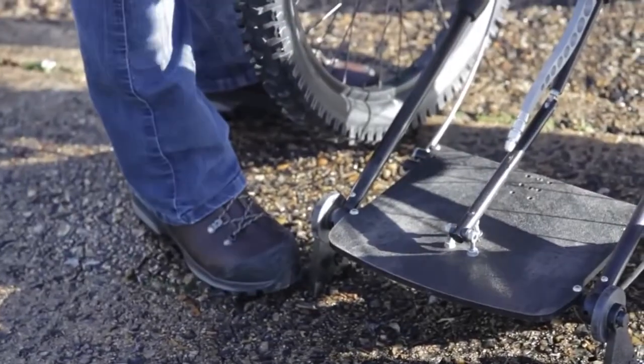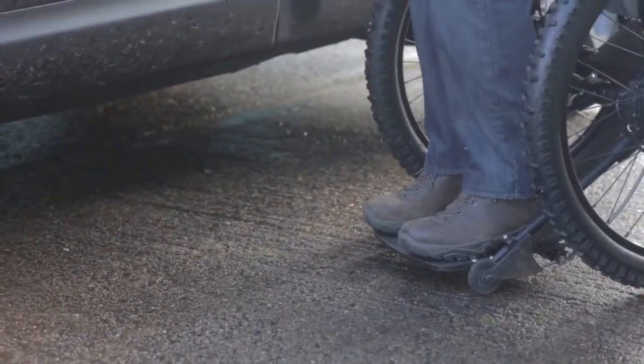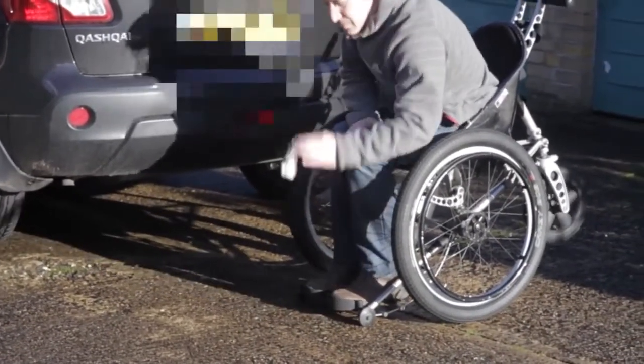The other benefits of the chair is the actual footrest with the small casters on either side of the footrest. It's great if you ever drop something on the floor. You can, with a little bit of practice, actually lean forward. The whole chair will tip forward. However, the casters on the front, the chair shouldn't tip any further forward than the casters will allow it to. It takes a bit of getting used to, it takes a bit of practice, but you won't roll out of it once you've had that practice. It means you can touch the floor all the way around the front of the chair and pick anything up.